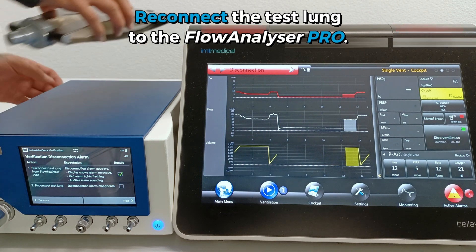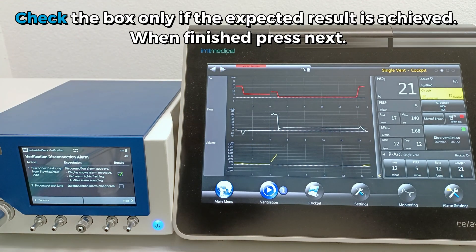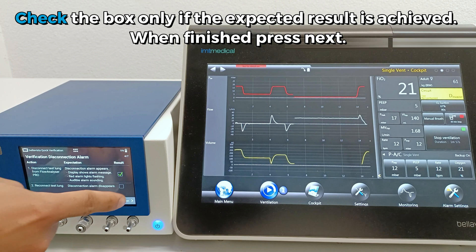Continue with Action Number 2 and reconnect the test lung. Again, check the box only if the expected result is achieved. When finished, press Next.